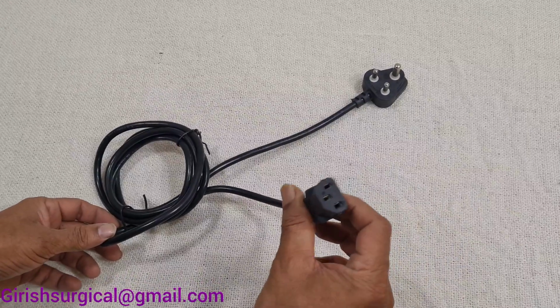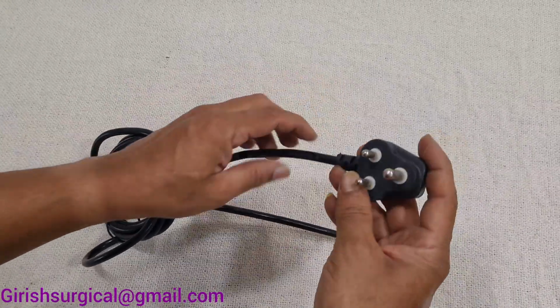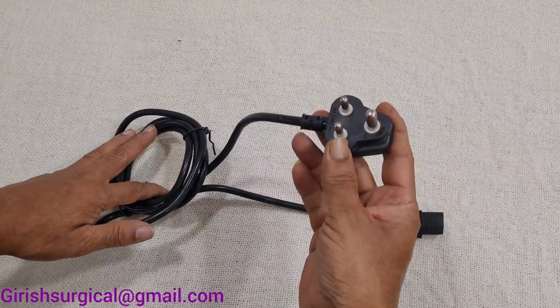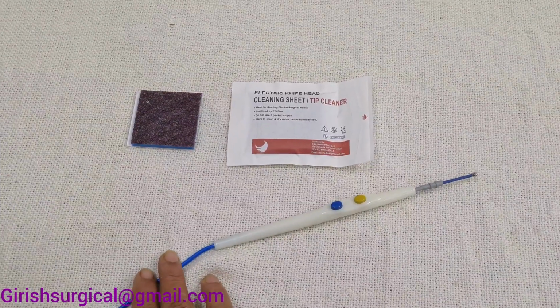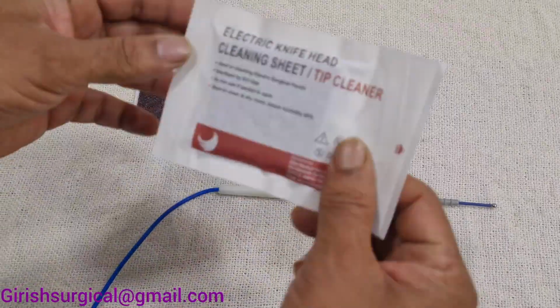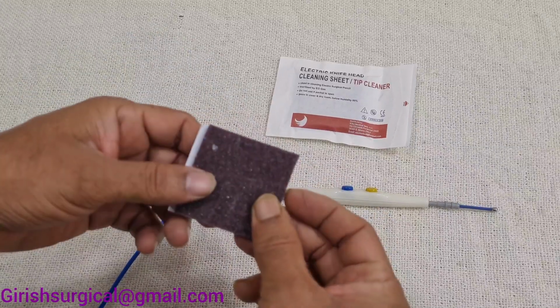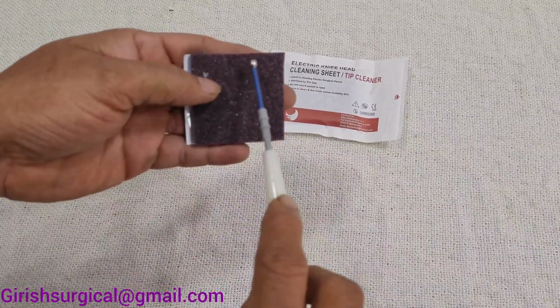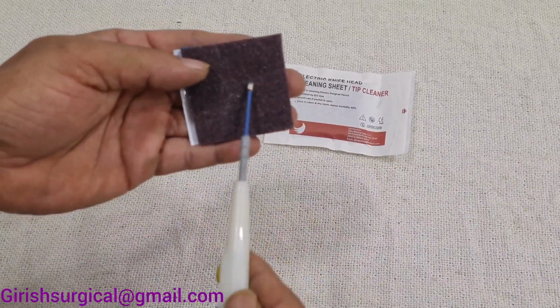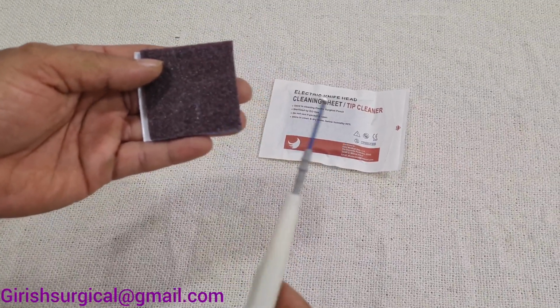Mains cord. This end will be going to the machine, and this 3-pin plug will be going to the electric board. This is the tip cleaner. It's a scrubber actually. So this tip cleaner, you can use it to remove whatever moisture is there, to clean the tip of the electrode.